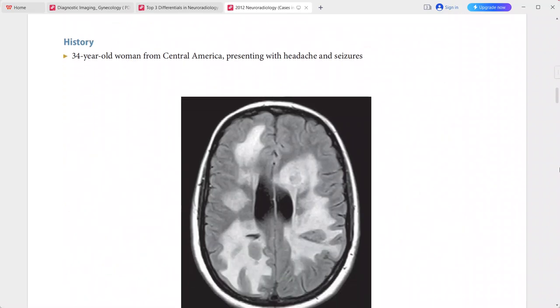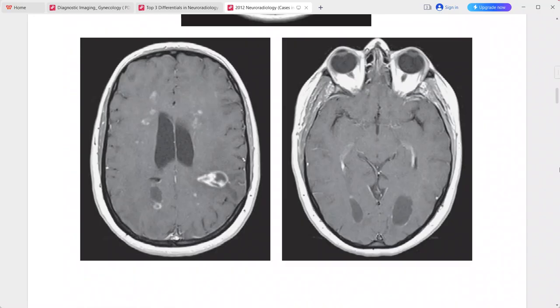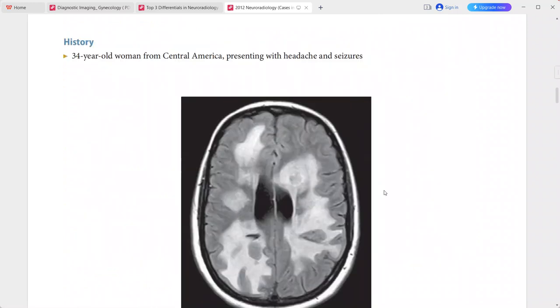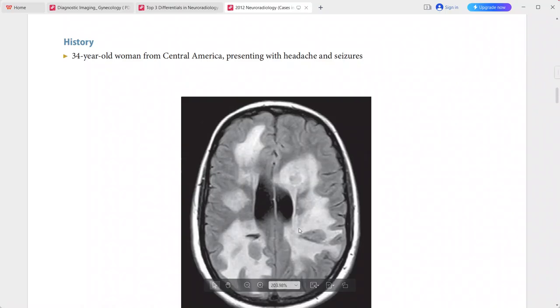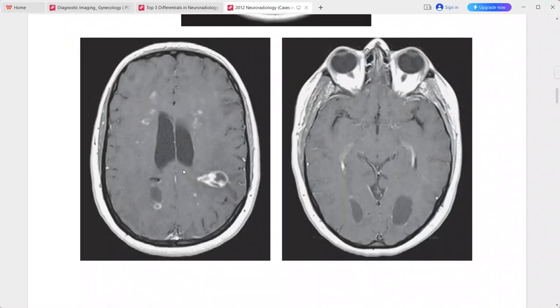Next: a 34-year-old woman from Central America presenting with headache and seizures. FLAIR shows extensive hyperintensity, likely vasogenic edema, in the white matter of both cerebral hemispheres.